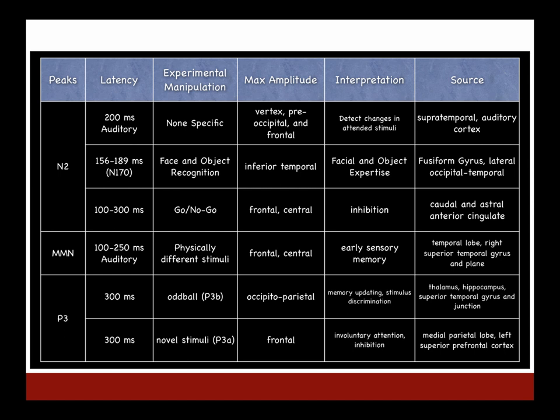The average hearing test performed in hospitals is that they basically either put headphones on the child or put speakers next to the child's head, and if they jerk their head in that direction, then they believe that the infant can hear, and if not, then they believe that the infant might have hearing problems. ERPs are absolutely good enough for clinical testing, and the state of Kentucky years ago was starting to implement EEG as a method for doing hearing screenings.